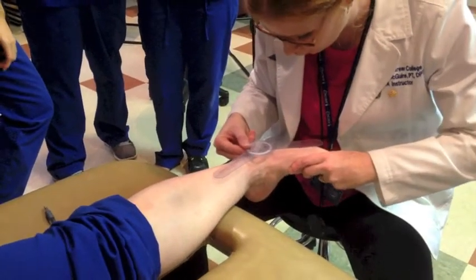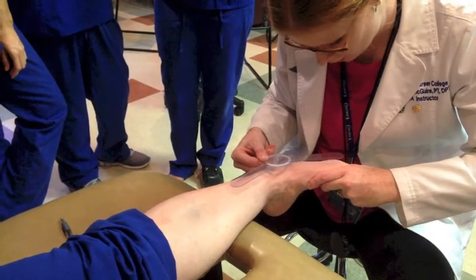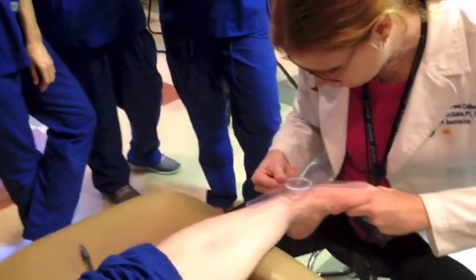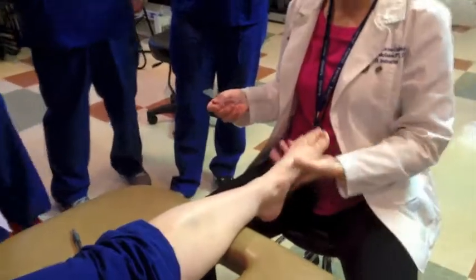I'm gonna invert her and find the second metatarsal. Looks like I overdid it a little bit. About 43 to 44. My accuracy is on today — different every day.